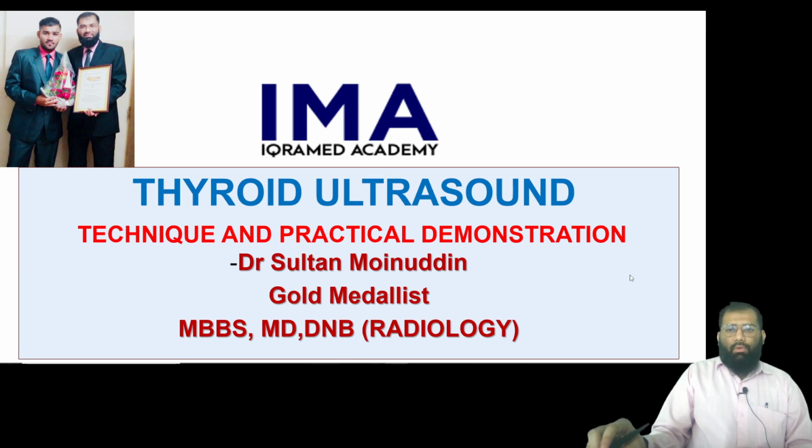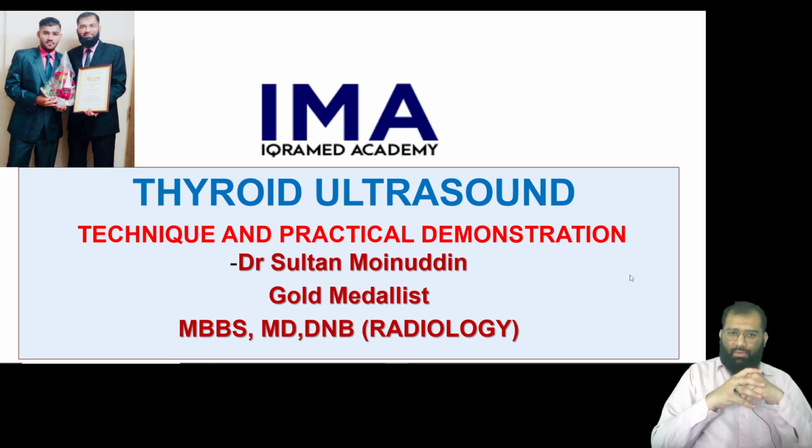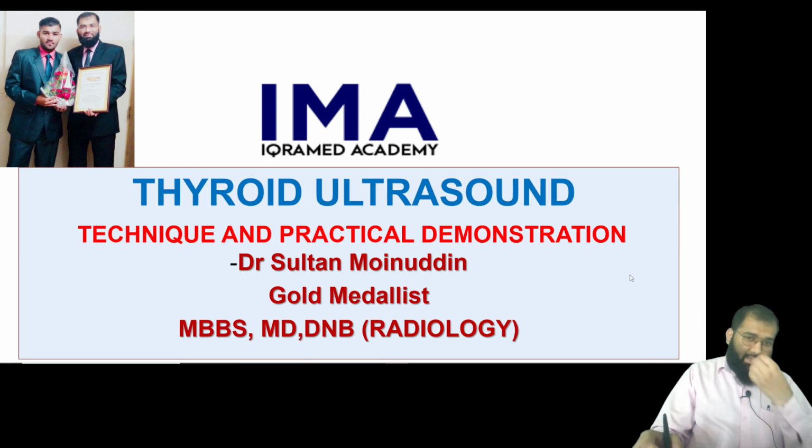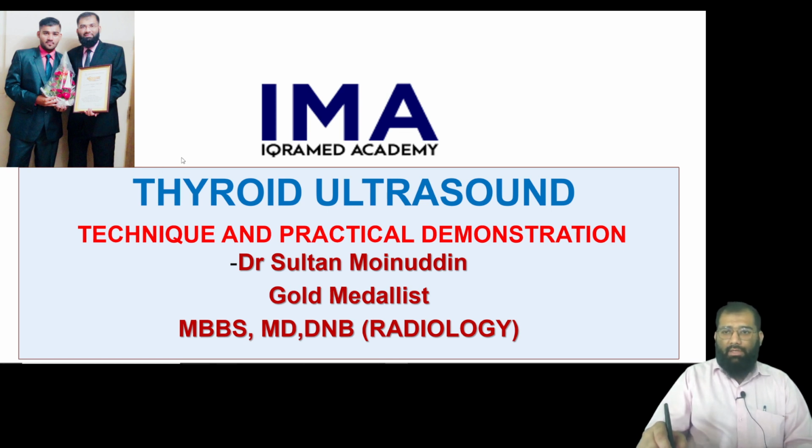And what we are going to see here in this session is about thyroid ultrasound. So in this session, I'll be talking about the technique and the practical demonstration of thyroid ultrasound. Okay. So without any delay, let us begin with the technique and practical demonstration of thyroid ultrasound.